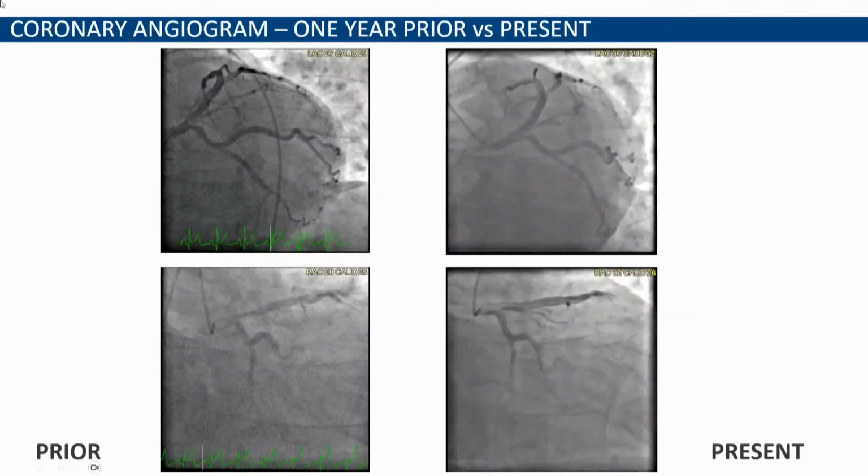So now you go back and you say, maybe I missed something in the cath. Maybe there was a lesion that I didn't see that can justify this finding. At a point in time like this, what you're looking for on the MRI is not just whether I see hyperenhancement or an area of LGE, but what is the location and the pattern, right? Exactly. Because it could be multiple patchy foci that make you think of something else.